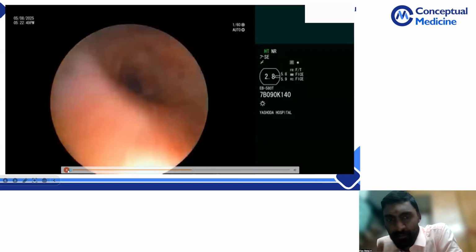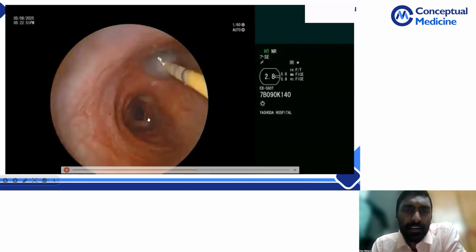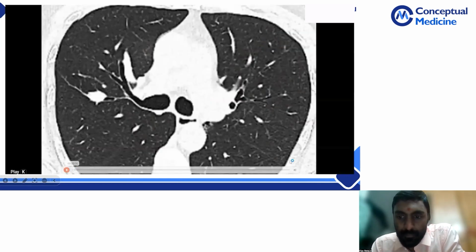Once you're taking a biopsy from the node or from the lung itself, this is not a node, this is from the actual lung tissue itself. So as you take, it will bleed. So to prevent this bleeding, you will inflate something called a Fogarty endobronchial balloon. Okay, what is this called? Fogarty's balloon. Okay. Fogarty endobronchial blocker. This is a nodule.